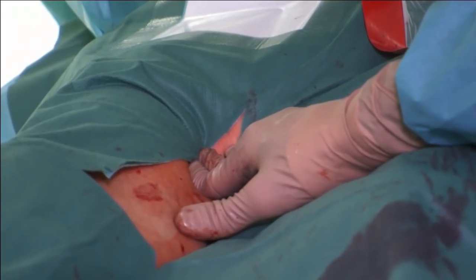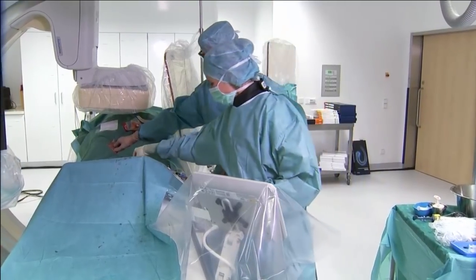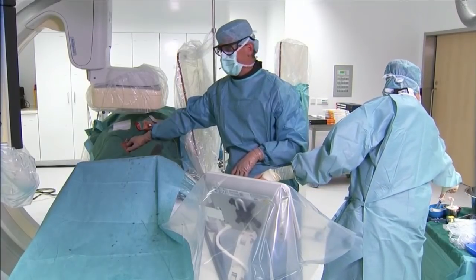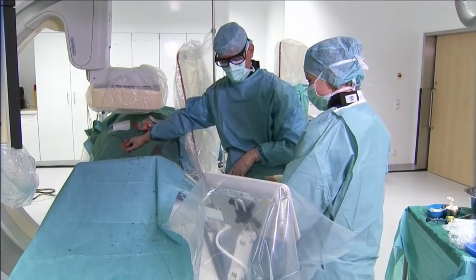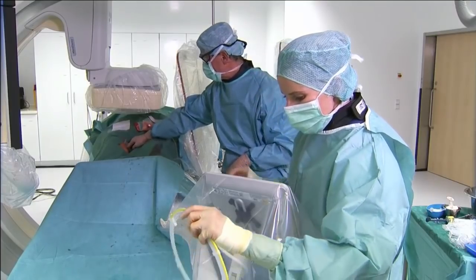It's also refreshing because we've been watching Andrej for years, and he almost always gets it the first time. So thank you for missing it a couple of times. You make us feel a little bit better. If Andrej can miss 2 times, then I can miss 5, huh? So, Andrej, I need to press here now a little bit.